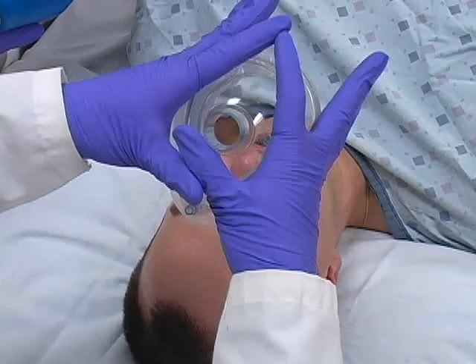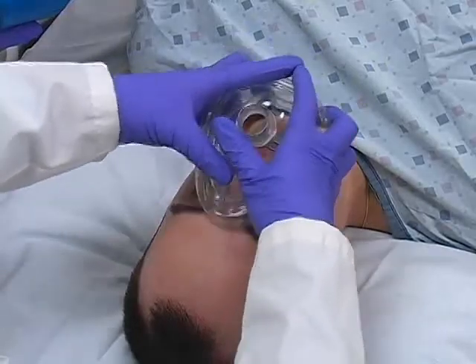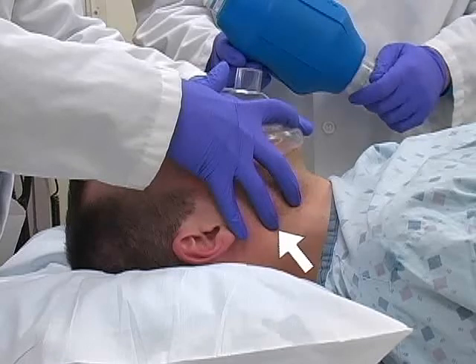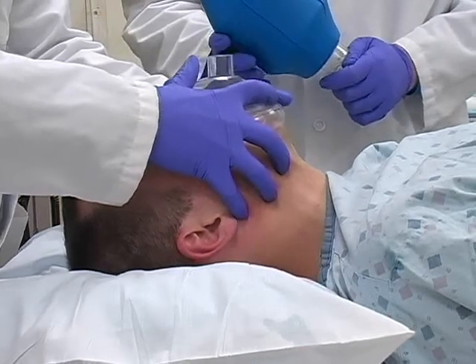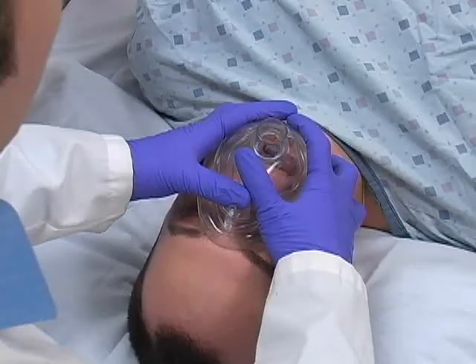The web spaces between the thumbs and the index fingers are placed adjacent to the connector stem, and then the mask is lowered onto the patient's face, nasal portion first. The middle, ring, and little fingers are placed along the underside of the mandible and pull the jaw anteriorly. The thumbs and index fingers hold pressure along the superior and inferior portions of the mask.